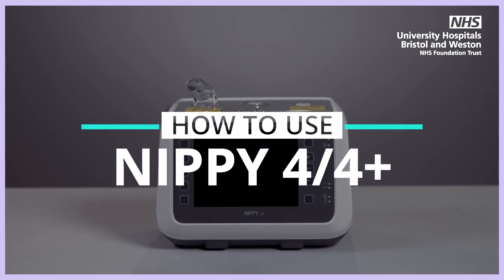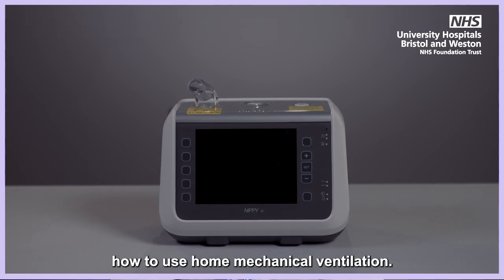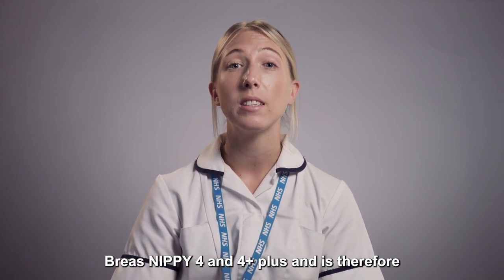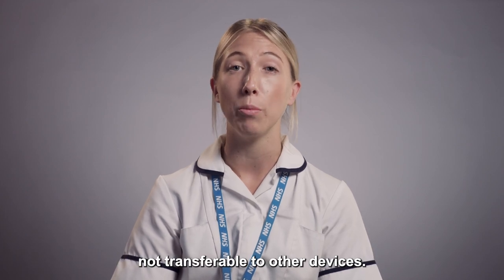NIPPY 4 and 4 Plus. This video provides training on how to use home mechanical ventilation. The training you are about to receive is specific to the Breas NIPPY 4 and 4 Plus and is therefore not transferable to other devices.